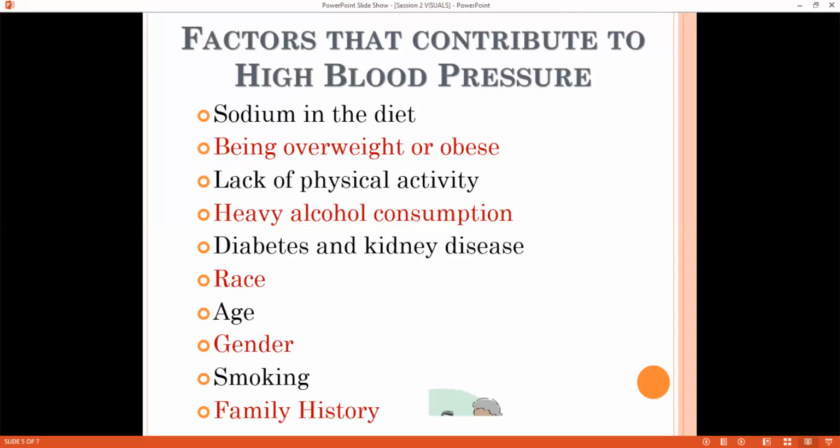The cuff, which is like a wide strap, wraps snugly around your arm above the elbow. Arms of different sizes require different cuffs. Like I said in session 1, it typically isn't a one size fits all. The monitor I have is the average monitor, but I definitely have a monitor with a smaller cuff and a monitor with a larger cuff. So if you think the monitor you received isn't the correct size, please feel free to reach out to me and we will get you situated with the right cuff size.